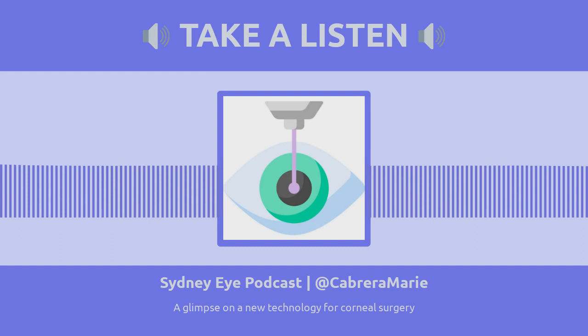So it's very quick. I mean, this technique can even be enhanced because at the moment our laser footprint is 1mm. But if the laser footprint can be designed to be bigger, essentially you can just put a patch on, zoop, and then you're done. You can be that quick because if you can make the beam bigger, this whole thing is covered in one hit. Well, indeed, it is much quicker than doing some stitches in the cornea.